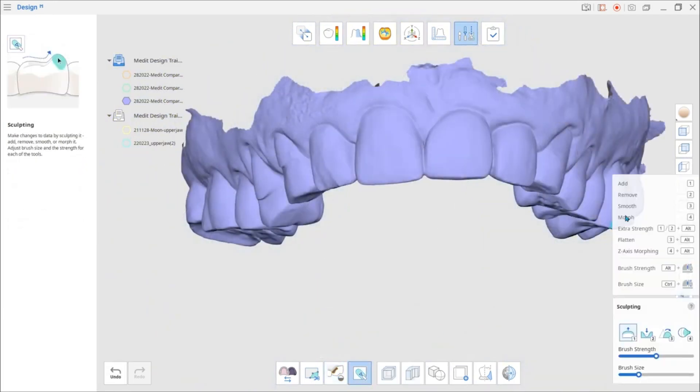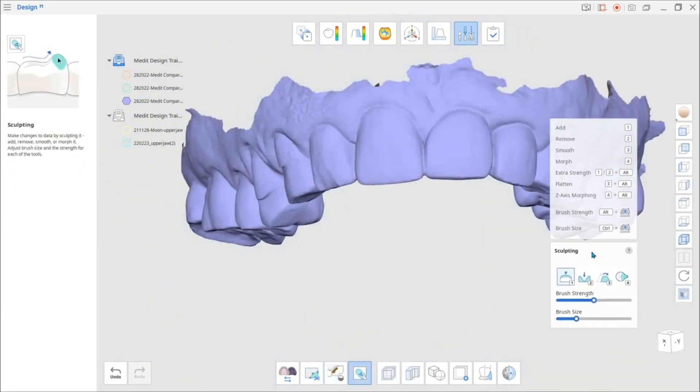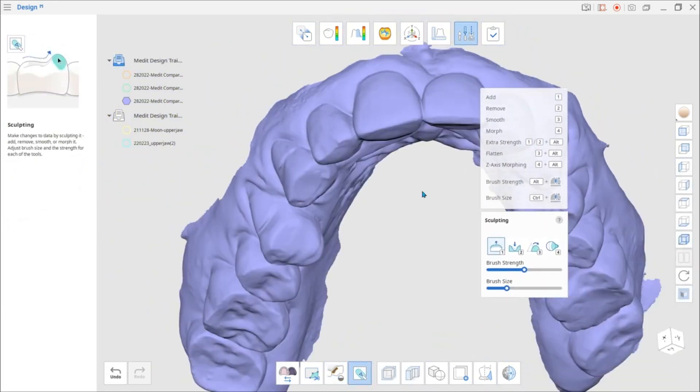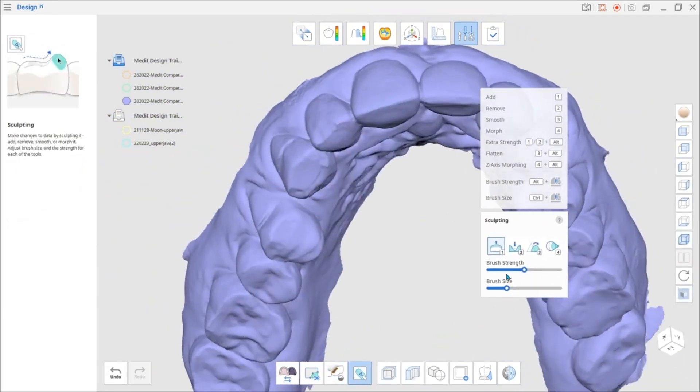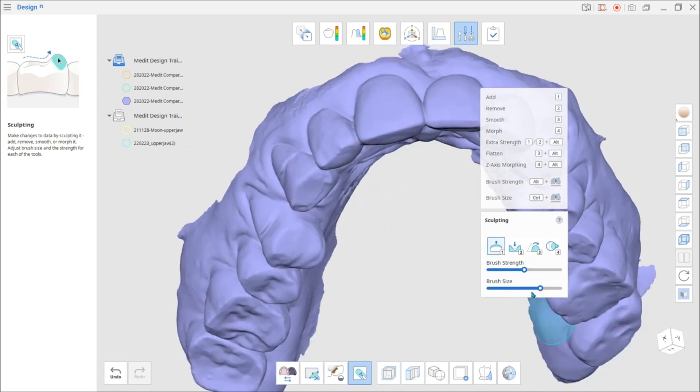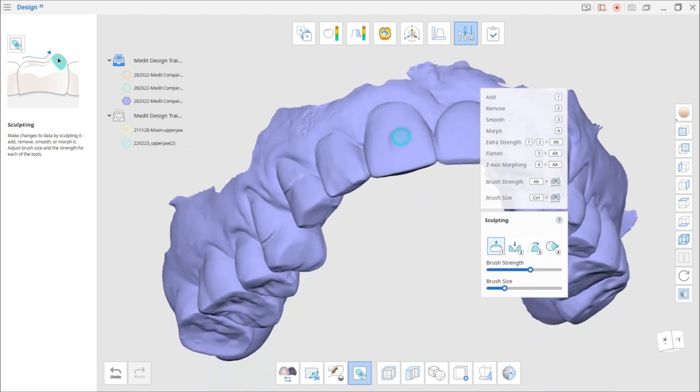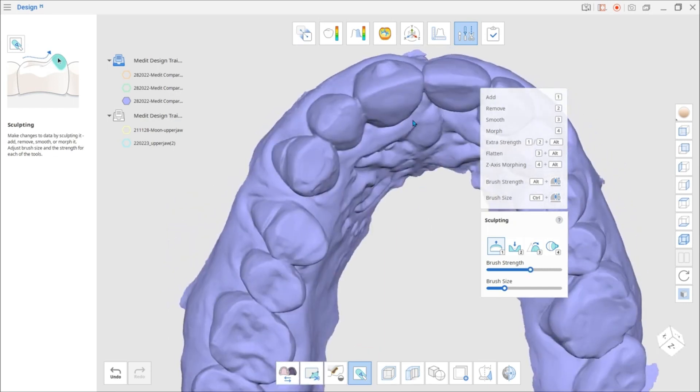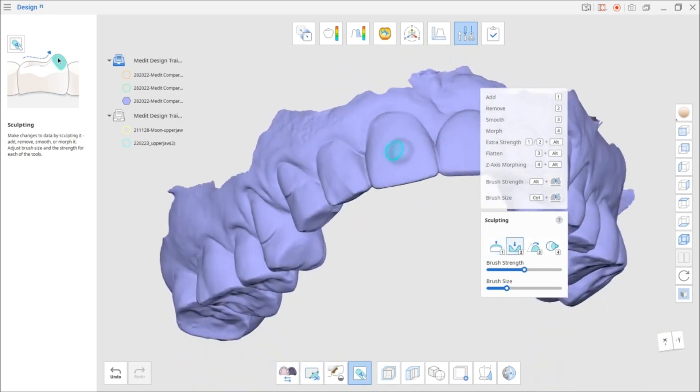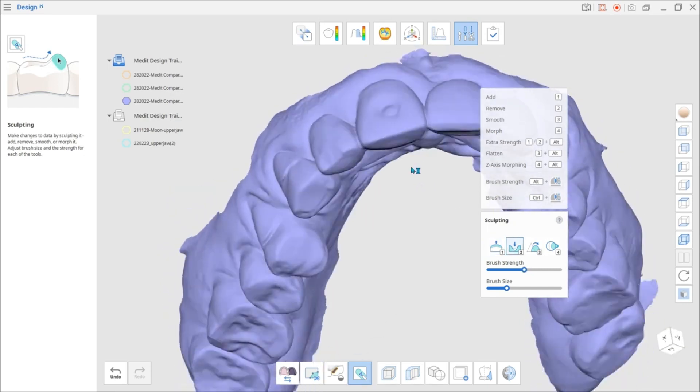Click the Sculpting tool to manually modify the scan data. Use the Sculpting Toolbox on the right to add, remove, smoothen out, or morph the data. Here you can also adjust the brush strength and size.